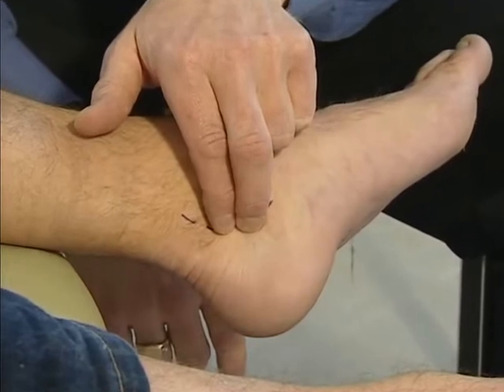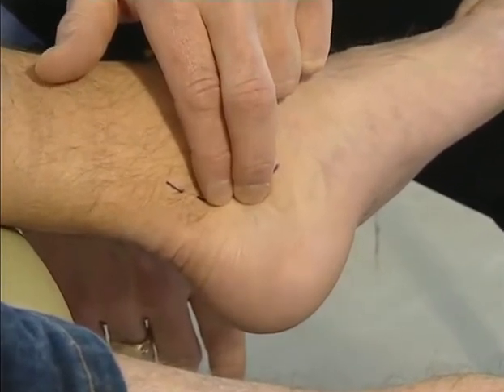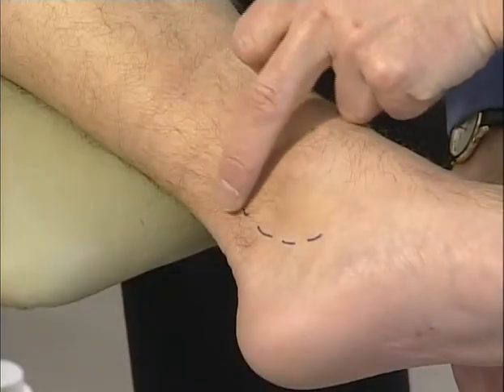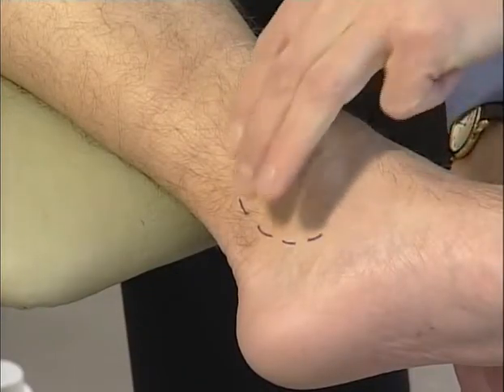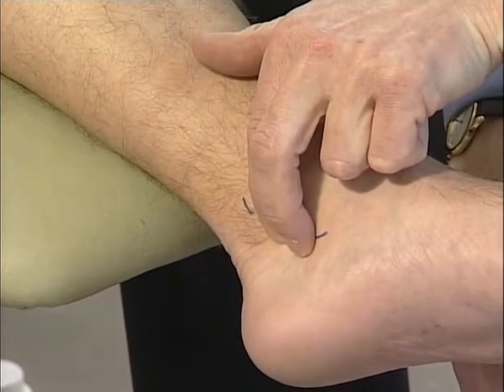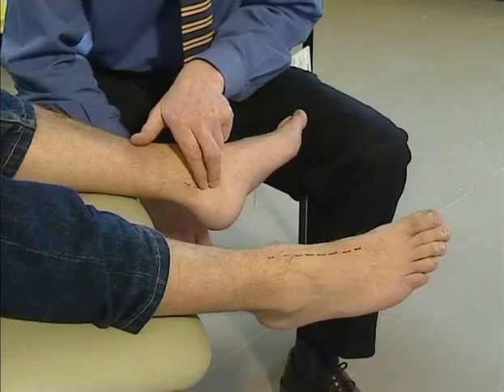The second pulse site is the posterior tibial artery, and, as the name suggests, it's located just behind the tibia bone. Here again you can see marked on the patient's skin the area where you should be able to detect the posterior tibial pulse.